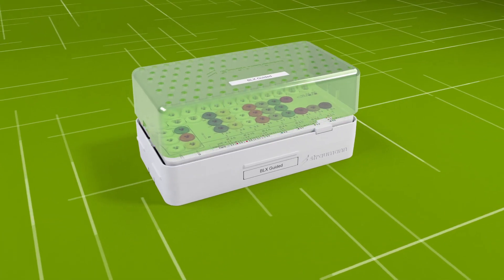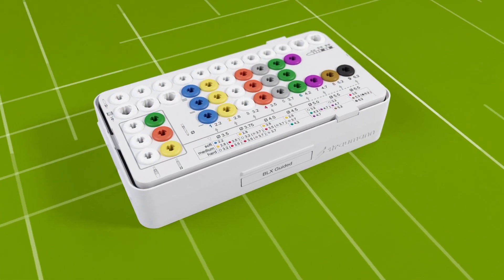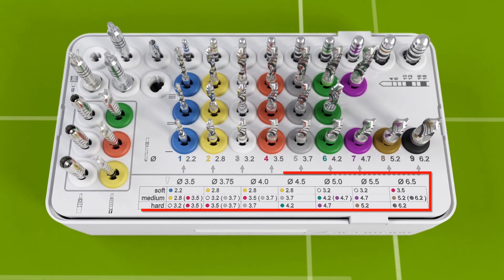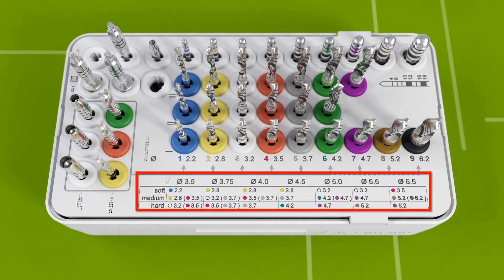The modular cassette shows the different final drill protocol according to bone class. Numbers in brackets indicate the drill used to widen the coronal part of the implant bed.